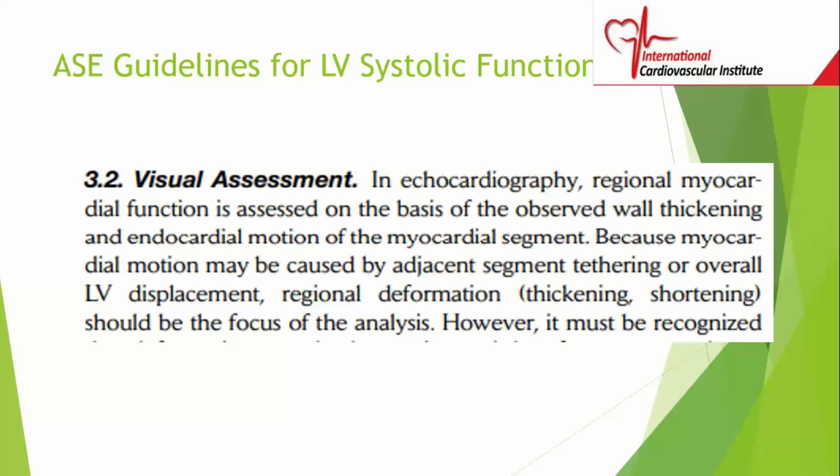The reason it has motion is because the normal areas around it are going to pull it. So it gives you the impression that it has good motion. Because myocardial motion may be caused by adjacent segment tethering or overall LV displacement, regional deformation, which is thickening and shortening, should be the focus of the analysis.